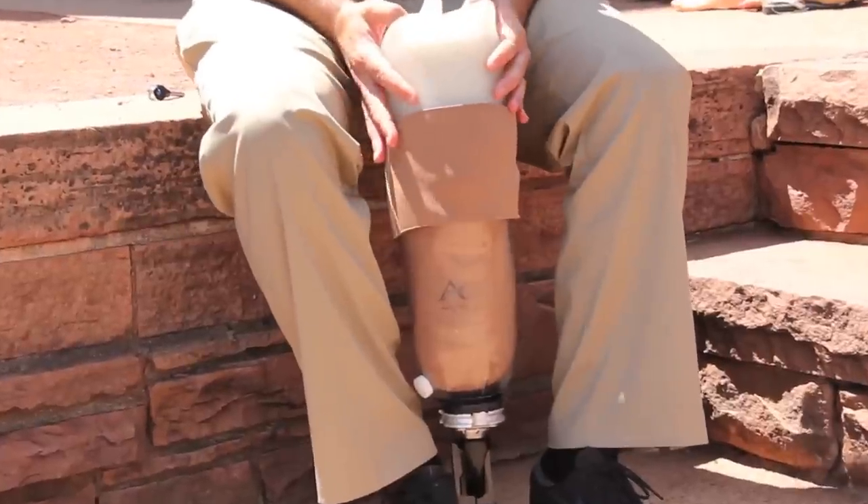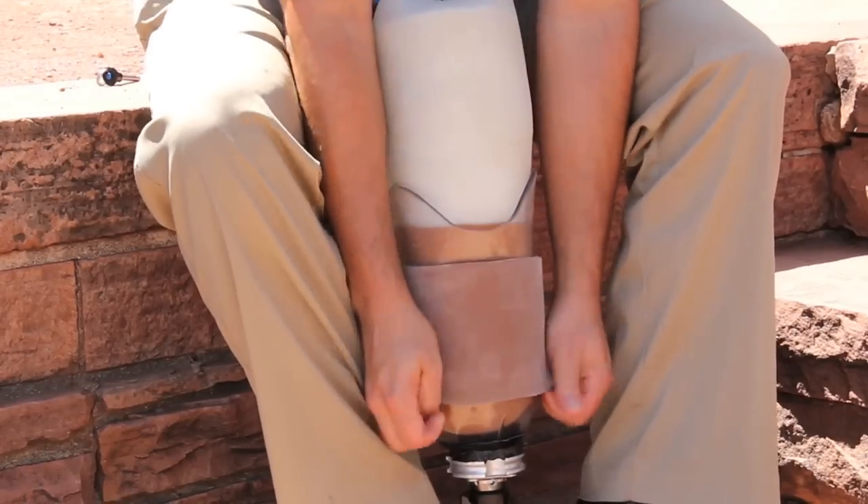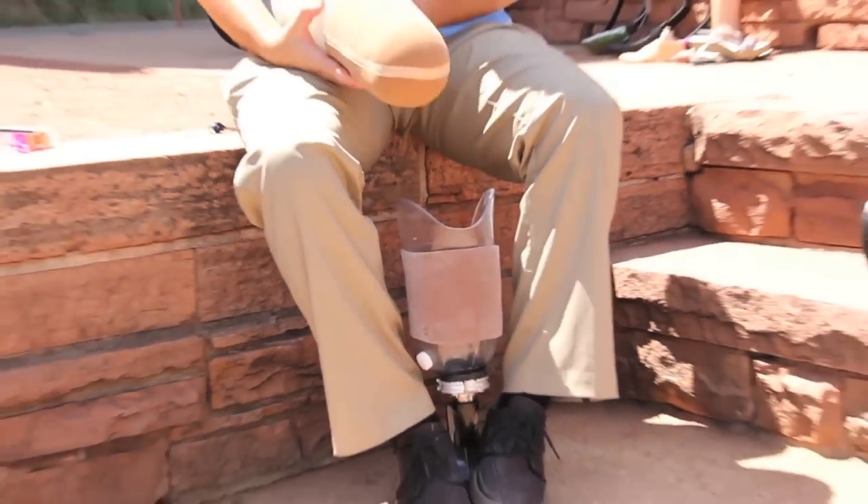This will create a closed system and therefore passive vacuum in your prosthesis. To remove your leg, roll down the external suspension sleeve and pull your limb out of the prosthetic socket.